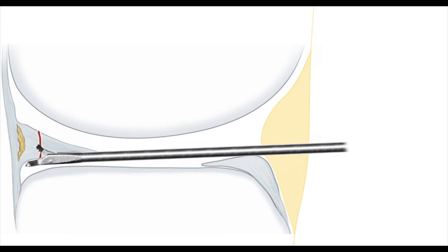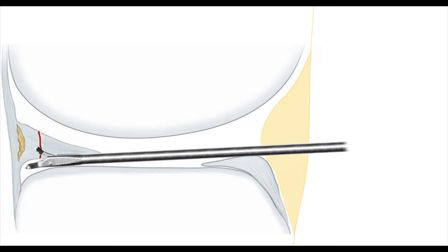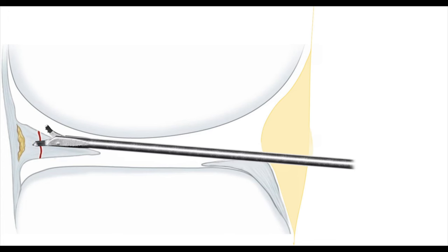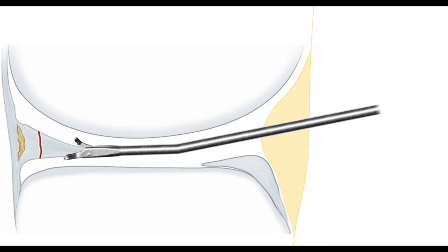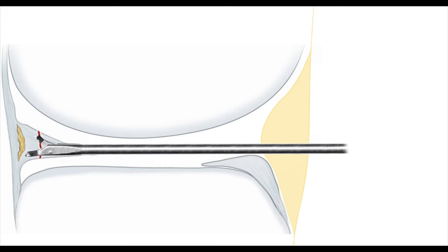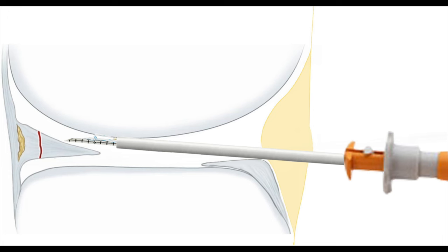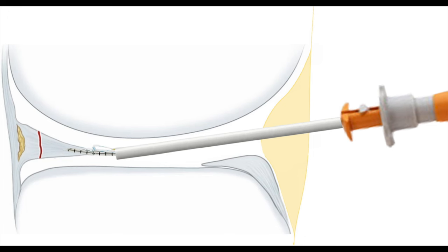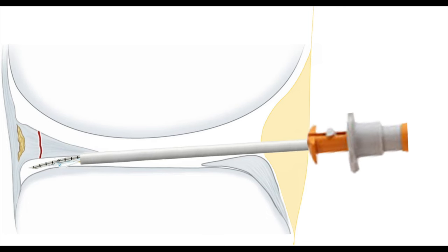Too high and the portal will force instruments into the tibial plateau posteriorly and into the femur proximally. Too low and the portal will force instruments into a superior vector that can only partially be compensated for by levering up on the skin and down on the anterior tibial plateau and anterior horn of the meniscus. If it's partial meniscectomy, using the best incision location and portal vector will allow you to easily debride the femoral and tibial sides of the tear. If you're coming in too high, you can really only debride the tibial side without the femur blocking you. If you're too low, the skin, anterior horn, and anterior tibia block you from debriding the inferior tissue. Some biters do have an up curve in the shaft which can compensate for a high portal, but finding the best portal will still give you the most freedom. It becomes even more important when using repair devices such as the FastFix 360 — even with a curved tip, a low portal lets you access only the top, and a high portal only the bottom. A best portal allows access to the full region of the meniscus.